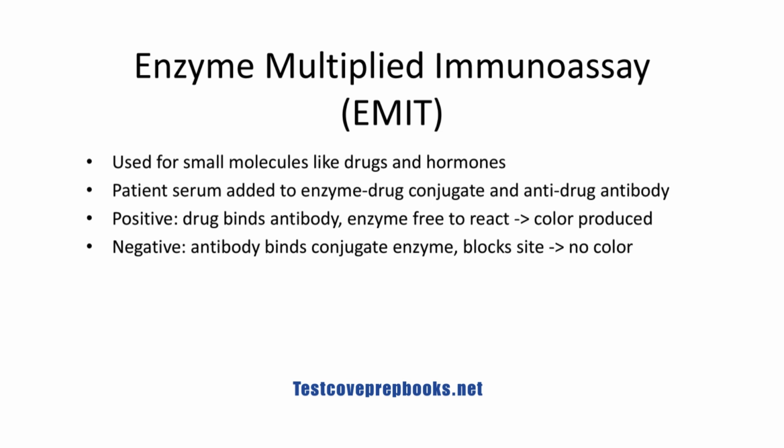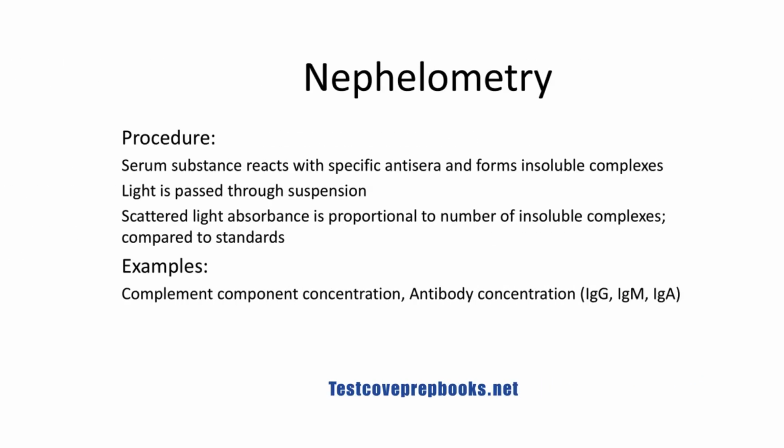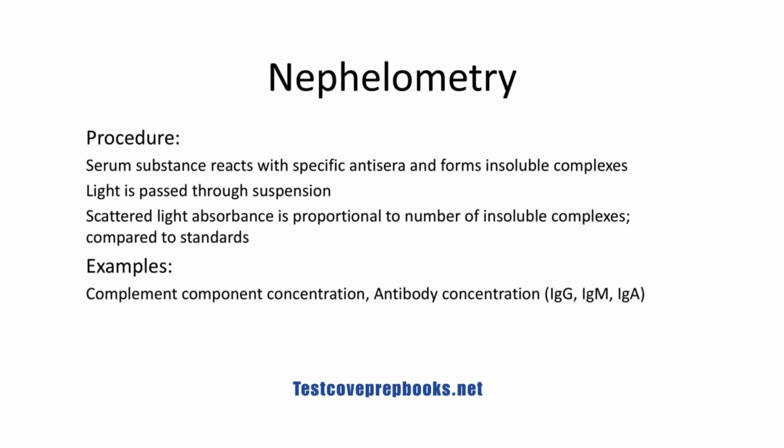In a positive test, the drug in the patient's serum binds to the antibody, leaving the enzyme free to act on the substrate, producing color. In a negative test, the antibody binds to the enzyme portion of the conjugate, blocking its active site, so no color is produced. Nephelometry. In nephelometry, a patient's serum substance reacts with specific antisera to form insoluble complexes.